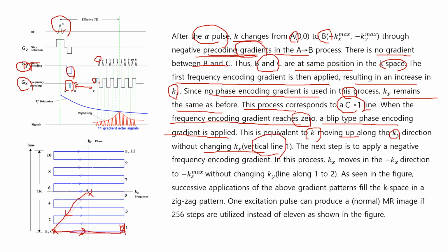The next step is to apply a negative frequency encoding gradient, this one, and we are moving in this direction.